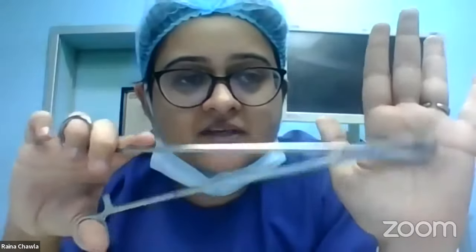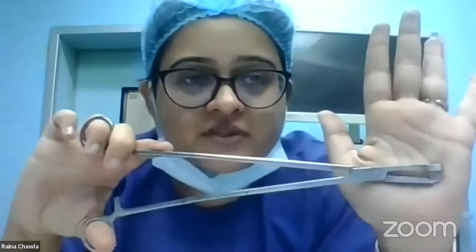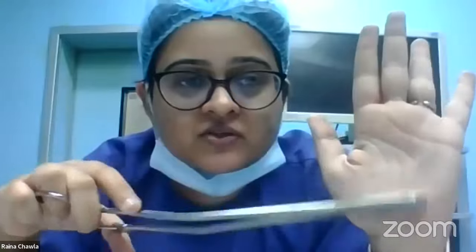Any doubts till now? No, ma'am. Nothing. Okay, all right. Next, so next important instrument, if we continue with vaginal surgeries, is this instrument. So what is this? Biopsy forceps. Yes, this is a punch biopsy forceps. Okay. So can you see this?